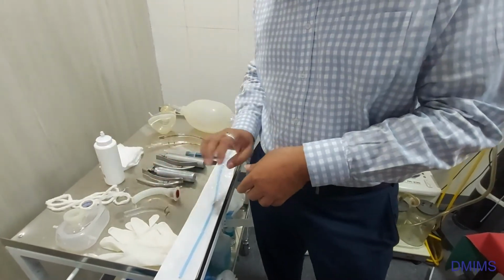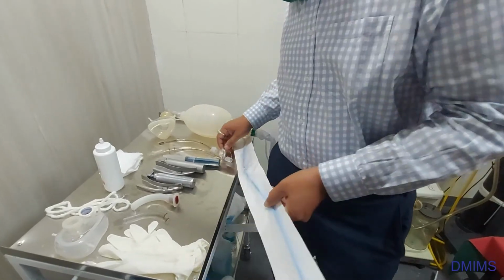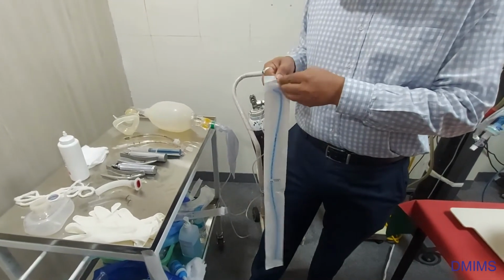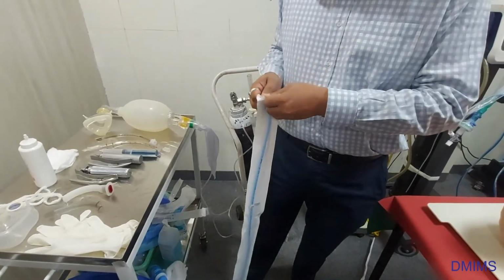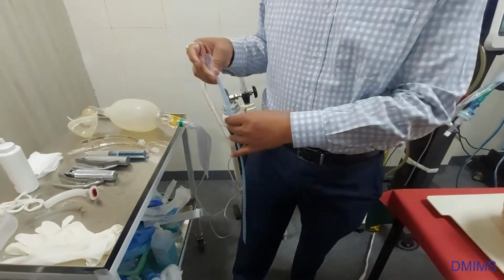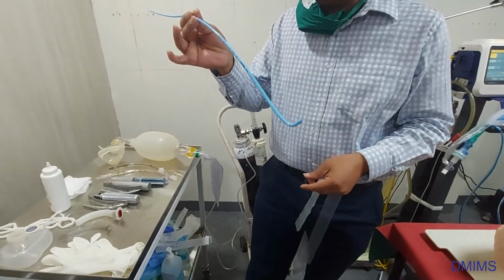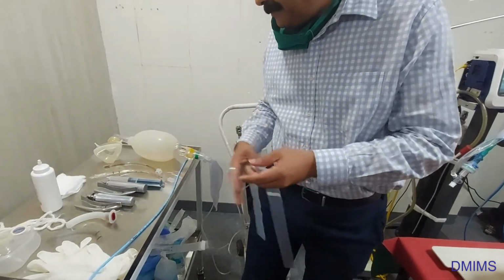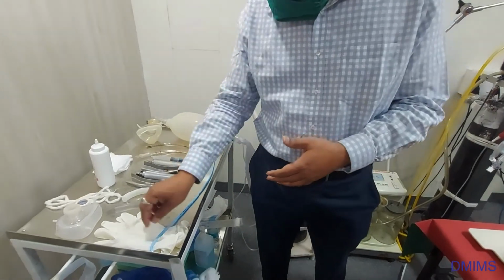These are adjuncts if there is any difficulty in ventilating the patient when intubating. This is the bougie. If you have difficulty passing the tube through the cords and the tube is not going in, you can push this bougie inside the cords. The J tip should go into the trachea, and then you railroad the tube. We will see it when we do the intubation. So these are the things we need, and we are ready for intubation. Put on the gloves.